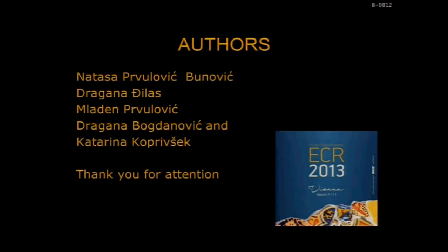Hello, Mihail from Romania. I wanted to ask you, you have done tomosynthesis only on oblique views? No, we performed both projections, MLO and CC, in the same act, so we used the combo technique. Okay, but I thought that you used only one tomosynthesis view, because sometimes it's very difficult to localize the lesions using only one view and after that to see where it is on CC view. No, we always use both projections. Okay. Thank you. Are there any other questions from the audience?